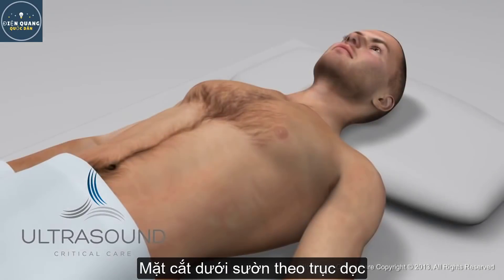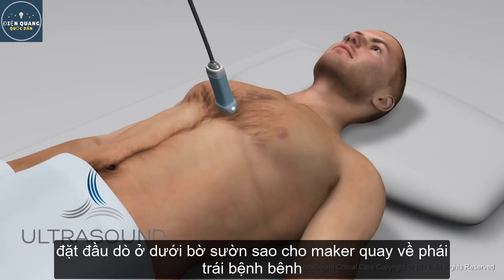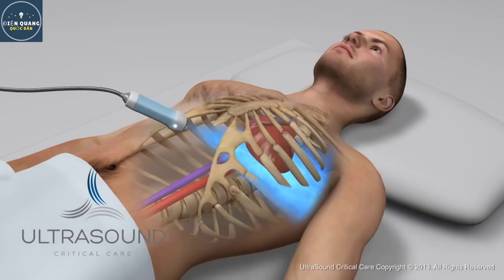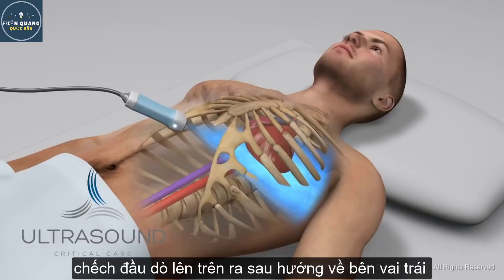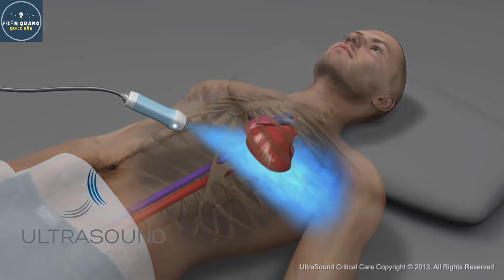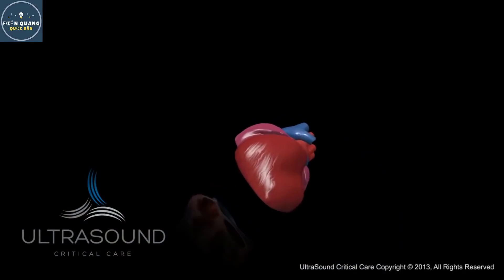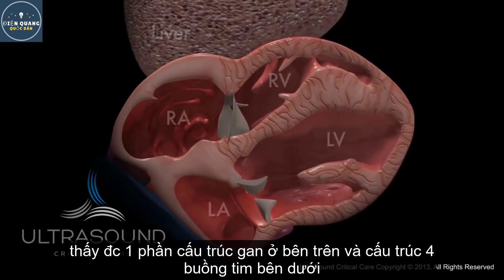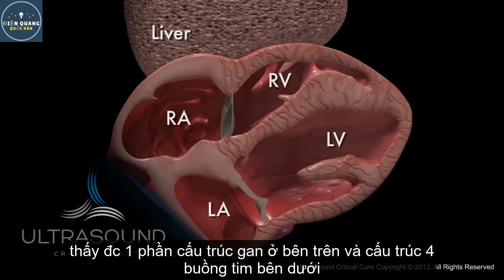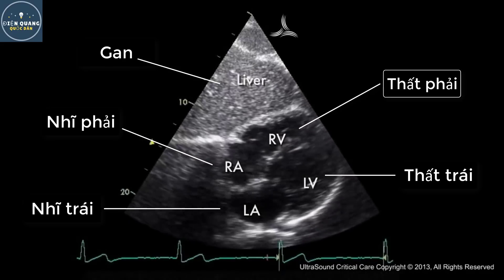Subcostal long axis view. Place the probe at the subcostal area with the dot aiming directly to the patient's left side. Press the probe down and angle it up and slightly to the left. You will note the liver at the top of the screen with the four chamber view below. The chambers are labeled for each structure.